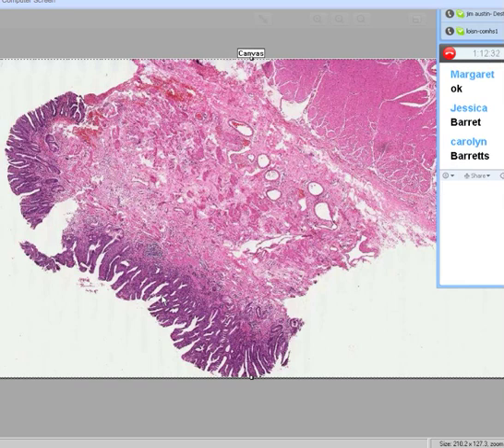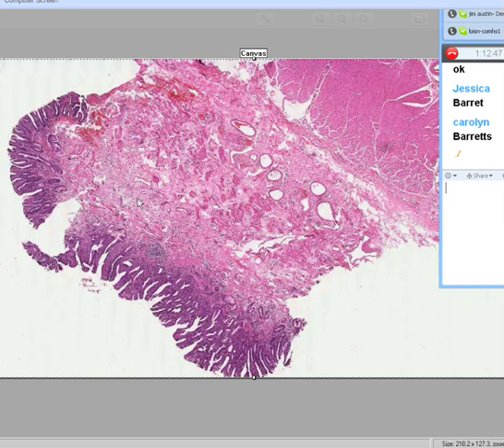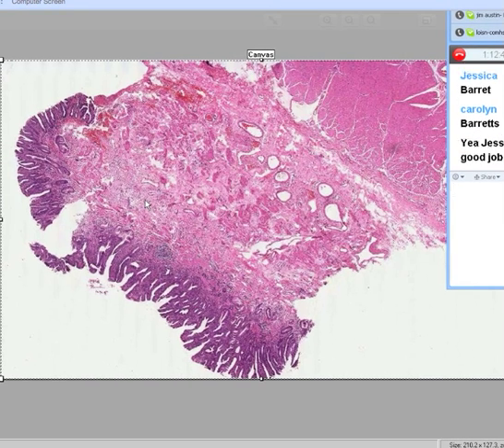Okay, folks, what's the diagnosis? Barrett, of course, Barrett. Thanks, Jessica. You get the gold star. And it's really a slam dunk easy diagnosis because you have intestinal or let's say gastric type of epithelium replacing squamous. Now you remember when we talked about metaplasia in general in chapter 1, we said usually the columnar cells are replaced by squamous cells in squamous metaplasia.